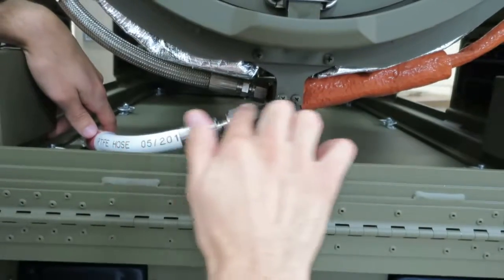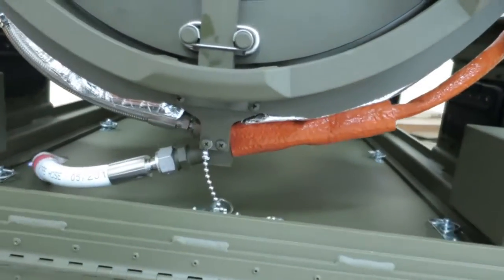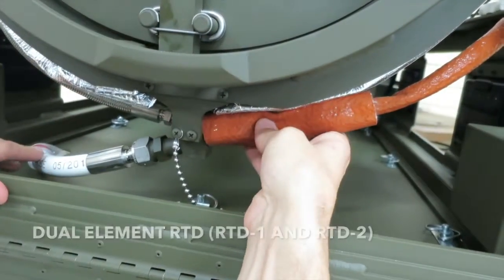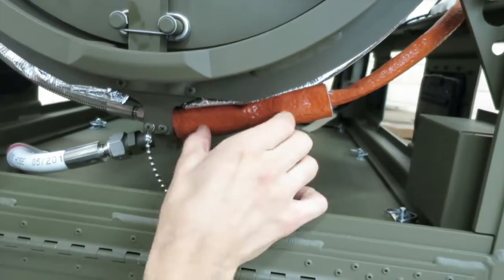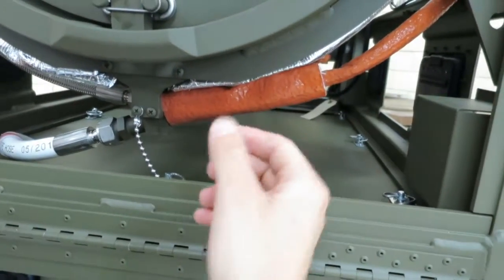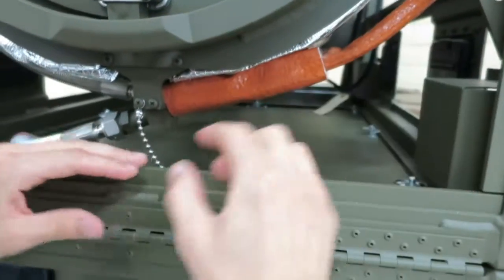That's why we have that angle there, so the condensation will drip down with gravity. Finally, we have the RTD probe. If I were to slide this insulation out of the way, I would see some 1/2-inch swage lock tubing there. And if I were to remove the nut right here, I could pull out the probe.